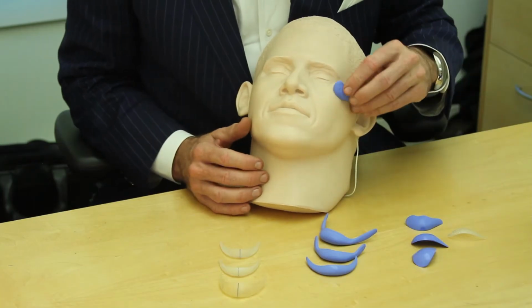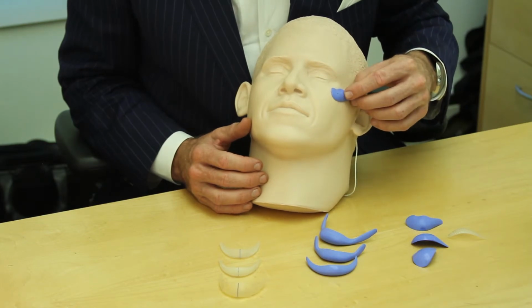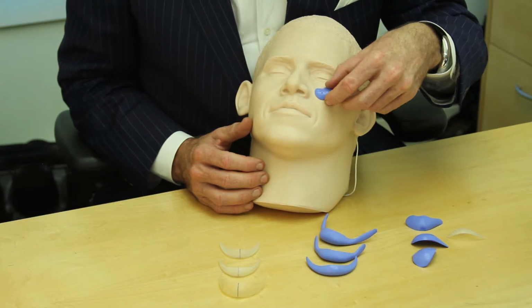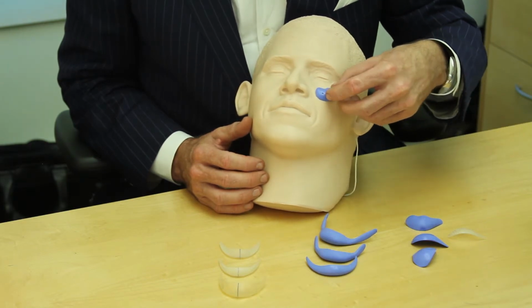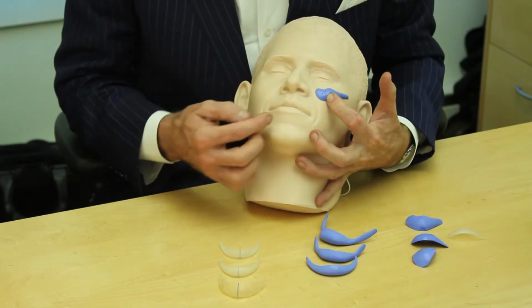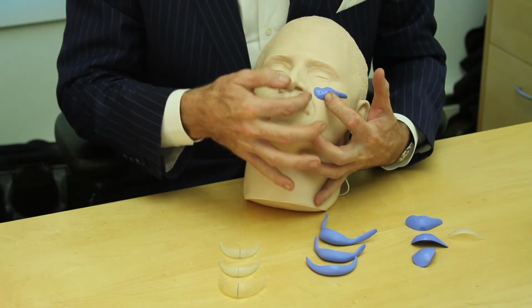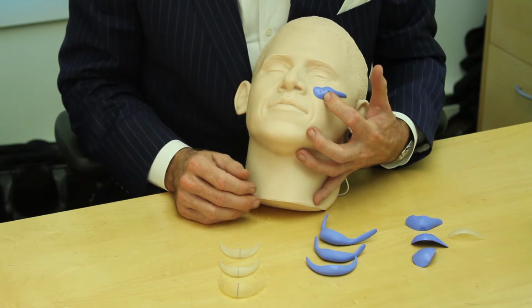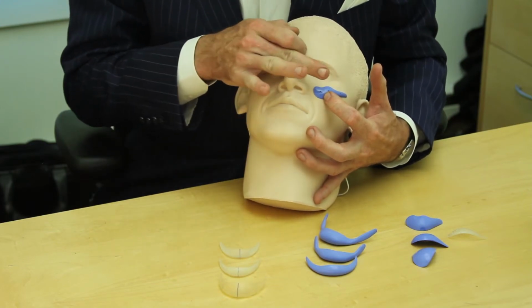Now this is closer to the traditional cheek implants that used to just sit right here as a little tiny bump on the cheek, but they're designed to be more natural in their contour by designing them in such a way that they lie flat on the bone. And when I place this, I'm going up underneath the lip and creating a perfect space for this to live in, so there's no external scar when I place these.